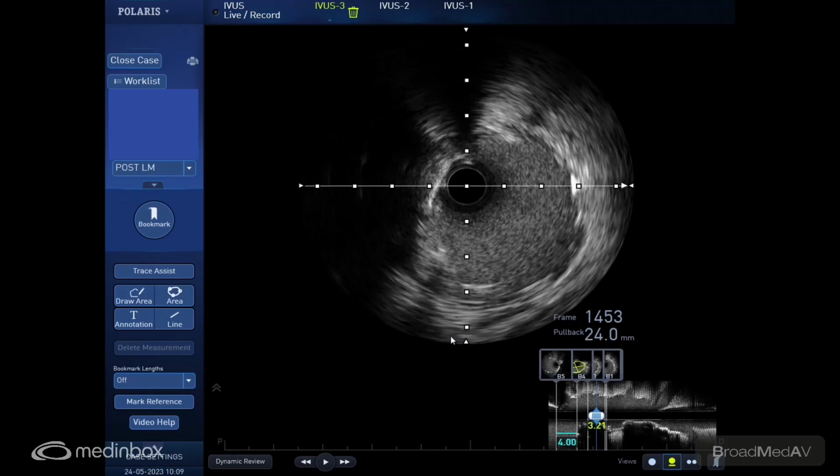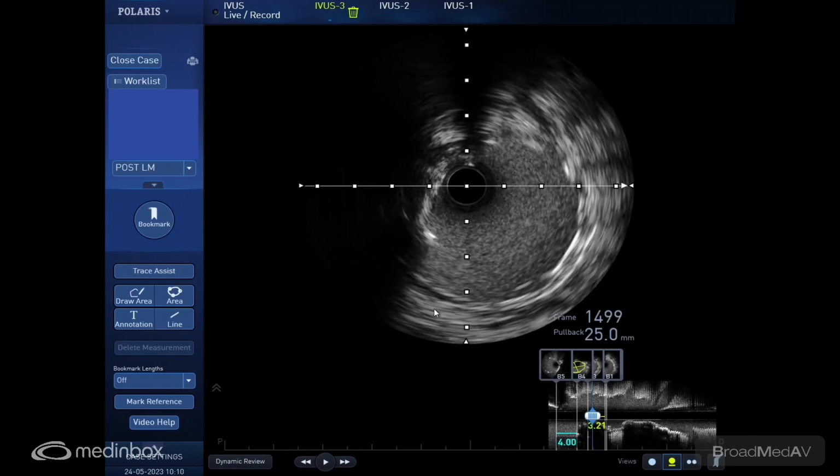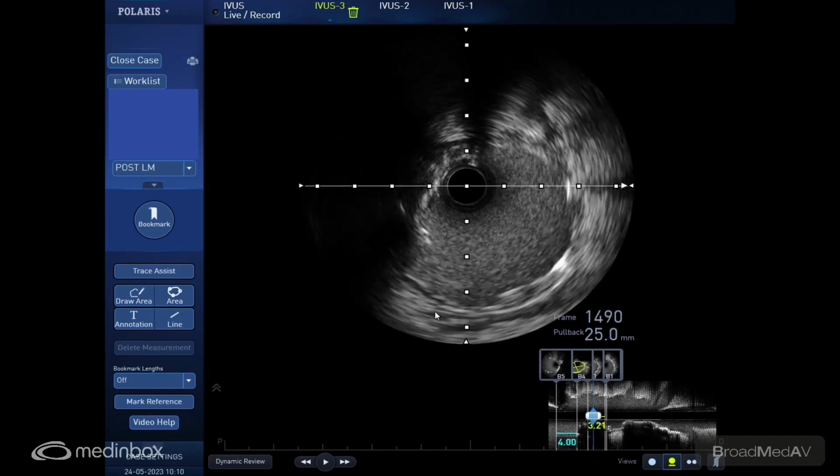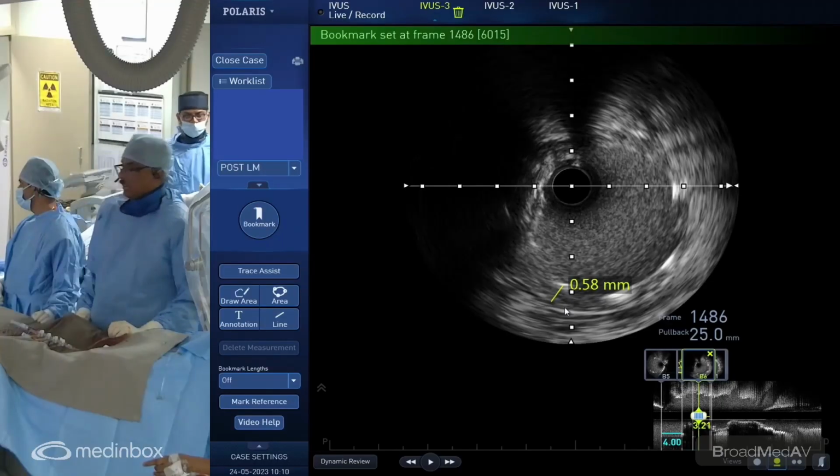But in an ostial, we always have this issue. Either we had only 1 millimeter into the bifurcation. We didn't want to get into the bifurcation and dissect it. So we are having a POT PTCA balloon at 5-6. No, I would rather have a routine 5. I want a little taper on the 5. The POT has no taper, and the problem is, when you go through this stent in the ostium, you've got to be very careful that you don't distort the stent. The POT balloon has no shoulders. Let me just have a routine 5.